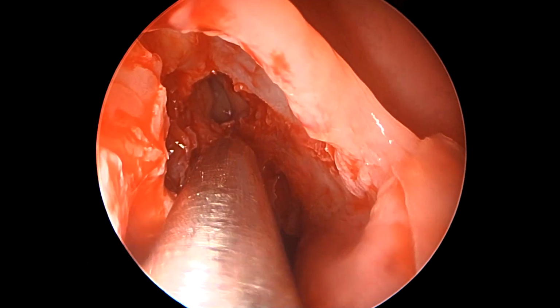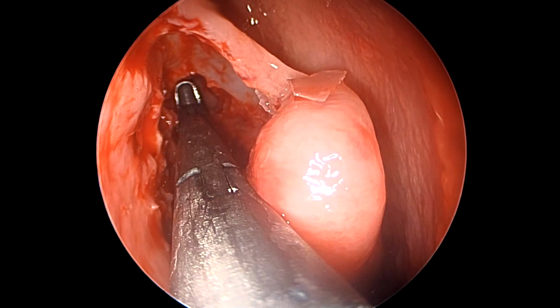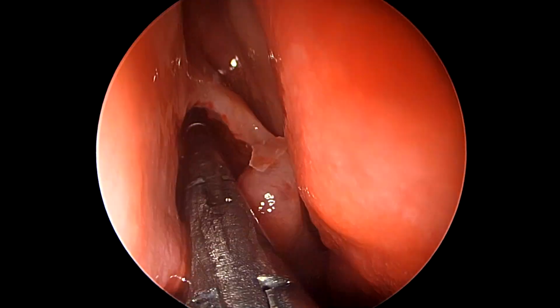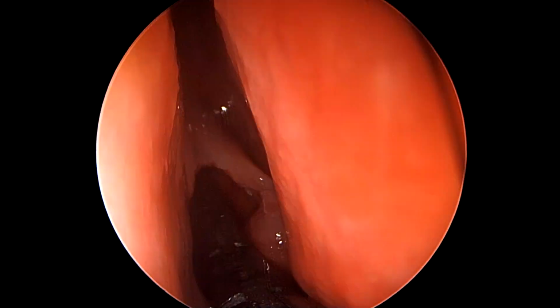We're using a navigator probe to see where we are, and if this indeed looks like the level of the frontal recess, what we find here is that it is not. So here we need to open this much more widely anteriorly to be able to get inside the frontal recess, and for this we use our articulated frontal punch.